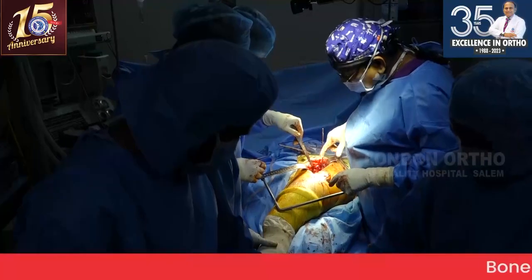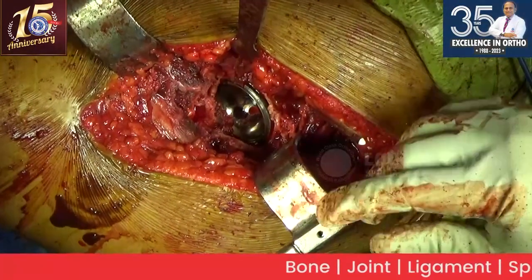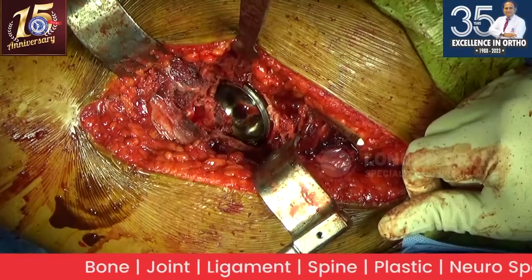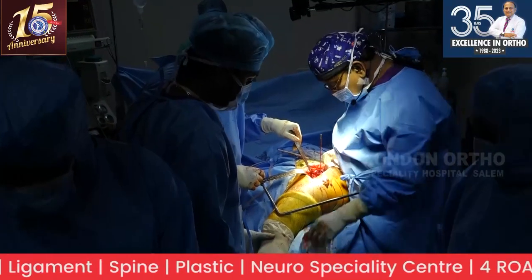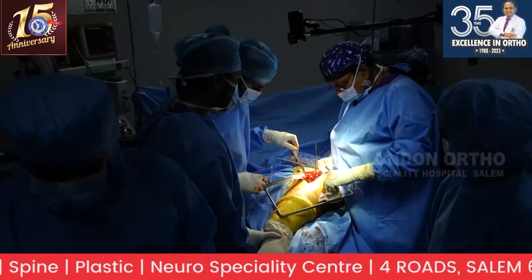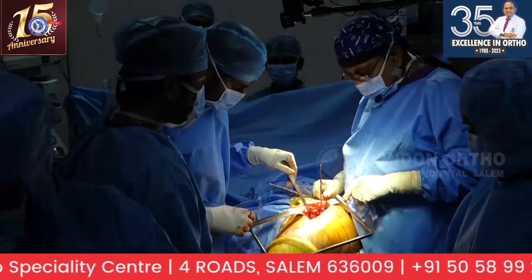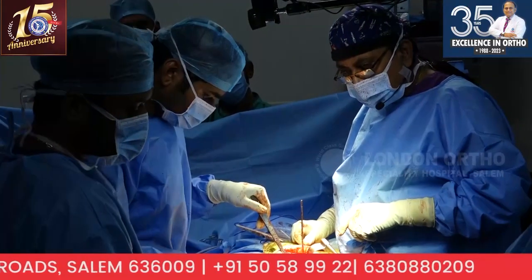The second screw is not fitting well, so I'm putting the third screw. Probably I'll remove the second screw after that fits well, and then put it again. So you'll put the third screw and then try to reposition the second screw. Yes. Or else it may toggle.